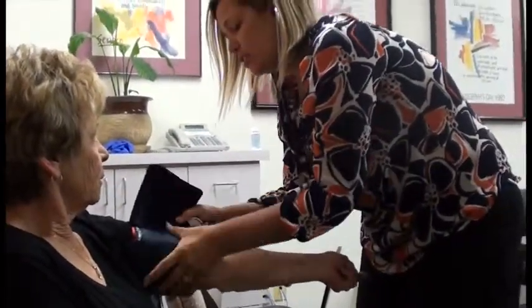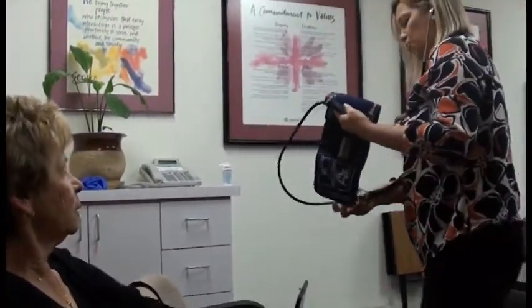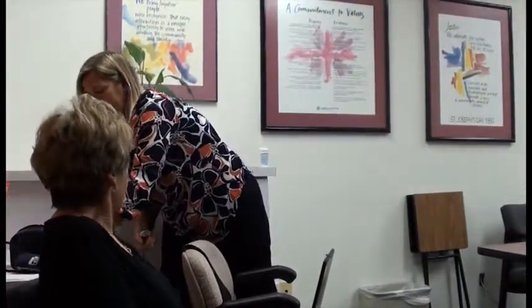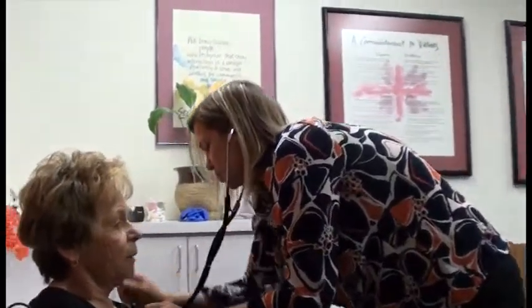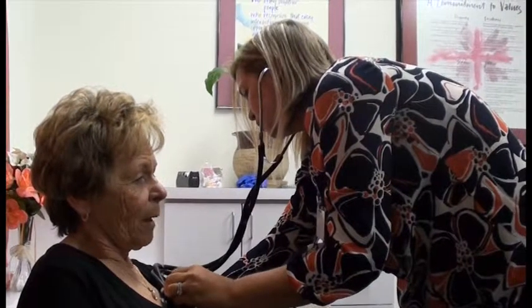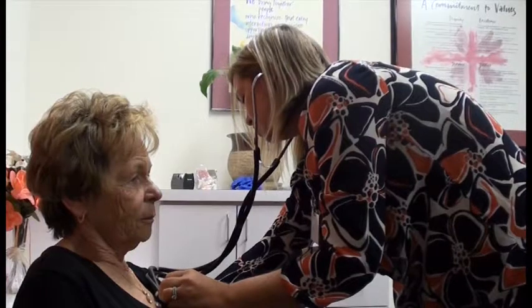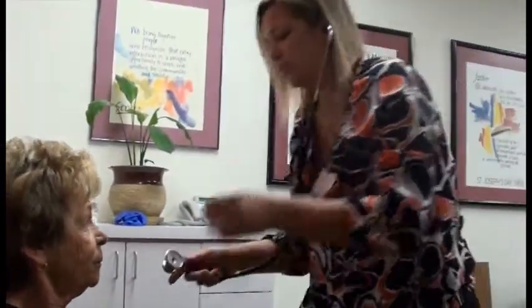Okay. It looks like it's 110/64, and that's in a normal range, so good job on that. Pretty good. My new medicine's working, I guess. Good job. I'll have to let the doctor know, because he took me off one. Okay, I'm going to listen to your heartbeat for just a second. You have a nice regular heartbeat. That's really good. That's always good. And in a normal range, it's 72.